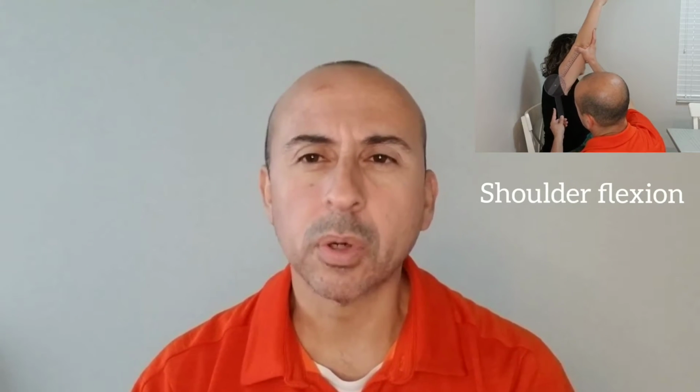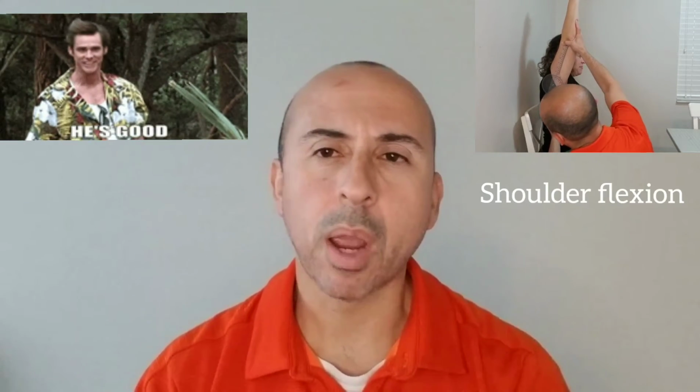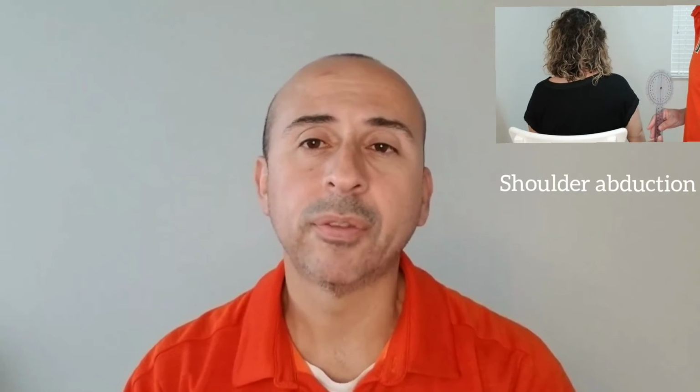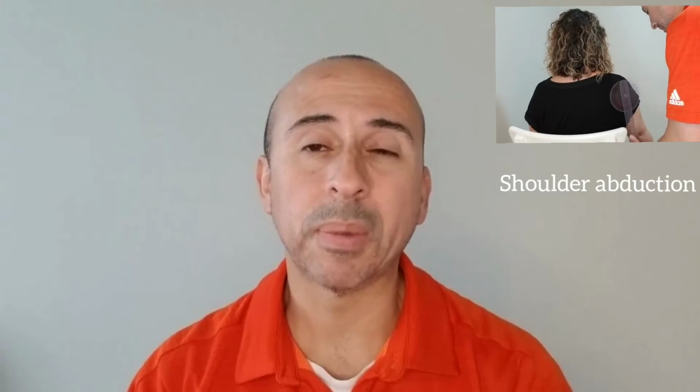As you look through your textbook at how you position the client, some of the textbooks will have a primary position, secondary, or alternate position. So you want to be able to know which one you're going to use depending on the specific scenario. In a testing environment, for testing purposes, stick to the textbook. In a real world scenario, you're going to try to get the person into a position as close as possible to that, but keep in mind that you might have to change the position to something that's easier for the client to be in, and also for you to be able to get access to that particular joint.